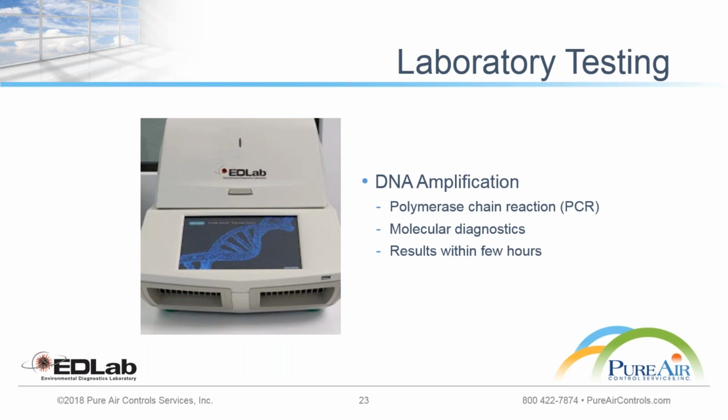As I said, the greatest advantage of this method is that it saves tons of time, and a rapid response is really possible. At least before the culture results appear, an evaluator can make a decision on how to respond to a scenario, whether an outbreak or epidemic is happening. So that is called the DNA amplification method. I just wanted to give you some more information on that.